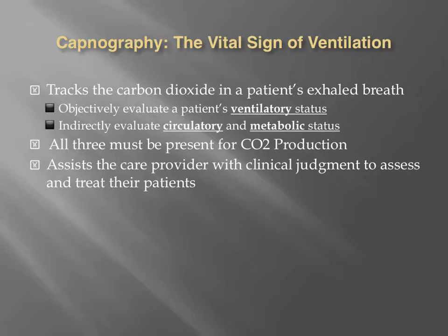Once again, let's review capnography, the vital sign of ventilation. We track carbon dioxide in the patient's exhaled breath. We're objectively evaluating the patient's ventilatory status, and we are indirectly evaluating the circulatory or metabolic status as well. All three must be present for carbon dioxide production in the body and for us to get that end-tidal CO2 reading. So we're assisting the care provider with clinical judgment to assess and treat their patients. That's what these messages are all about with these lessons.